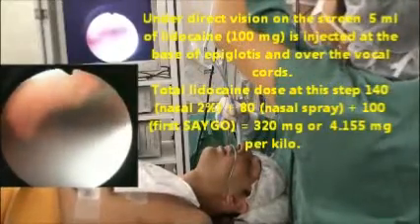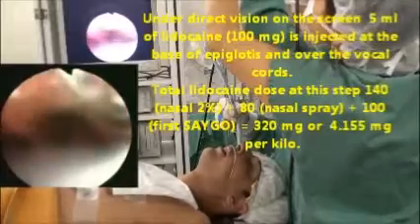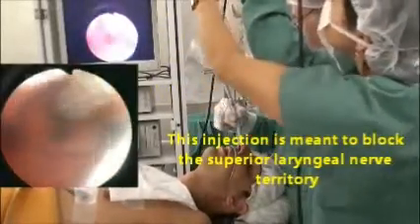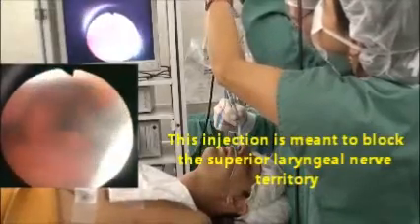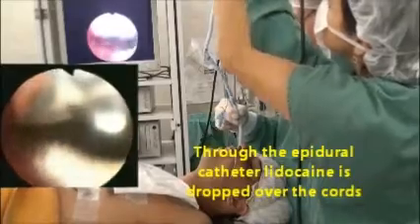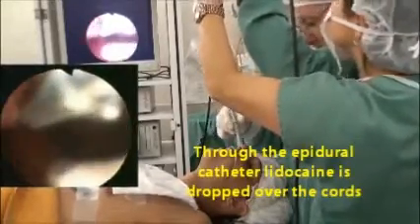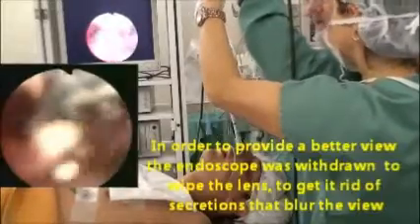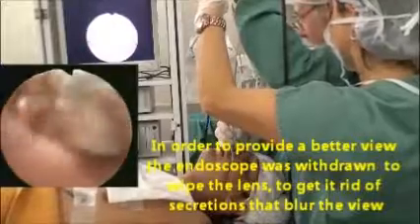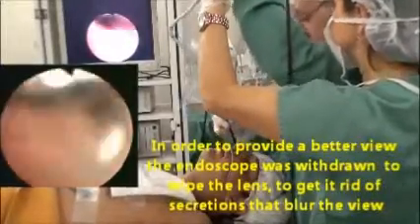The epidural catheter is threaded through the working channel of the fibroscope in order to administer 2% lidocaine at the base of the epiglottis and over the vocal cords. The patient was previously warned at this point that an urge to cough might appear. In spite of that, only a mild cough occurred due to lidocaine dropping over the cords.